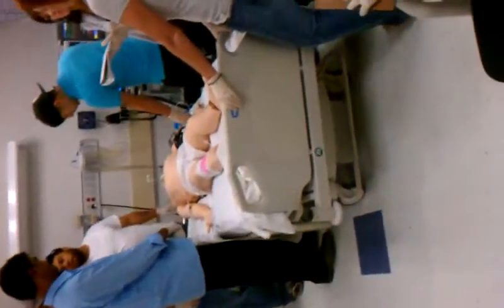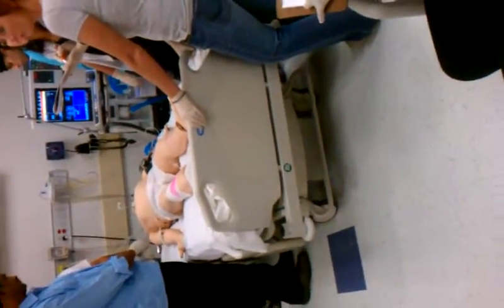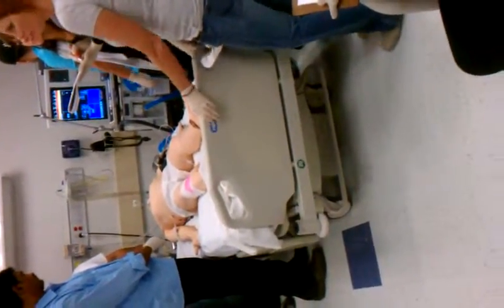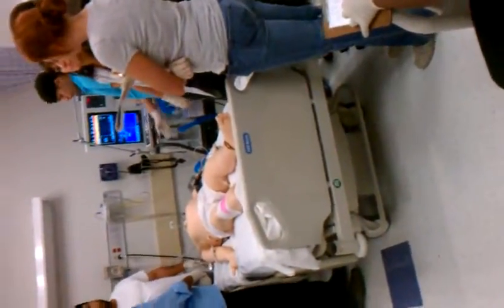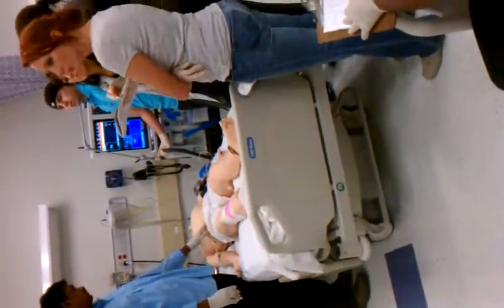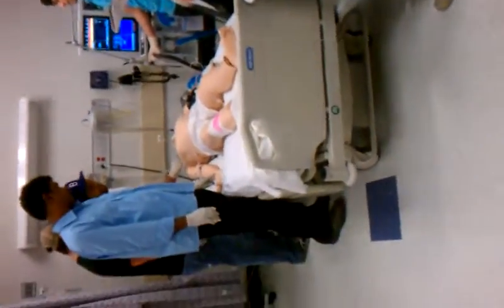Now, if his PO2 were 81, then I might, but it's not. So remember, look at the blood gases, and don't always change it just because, well, you know, we're in metabolic acidosis. But if they don't give you a bicarb, then there's nothing else to change. You're going to maintain. 81 wouldn't be okay still because it's within that normal, it says 80 to 100. Yeah, 81 might be all right, but I might increase a little bit at 81. I don't know, but 81 would probably be all right.